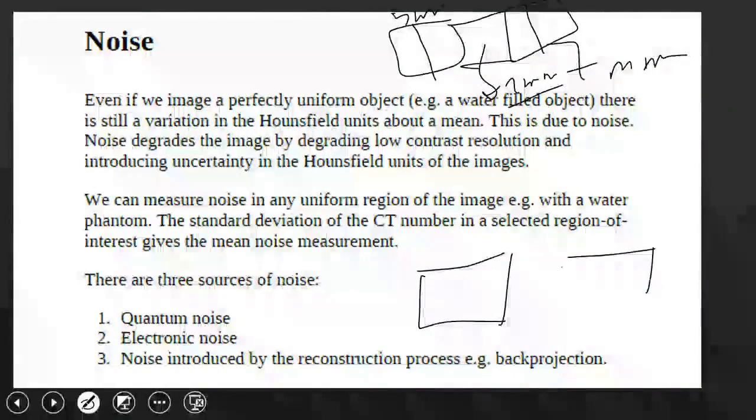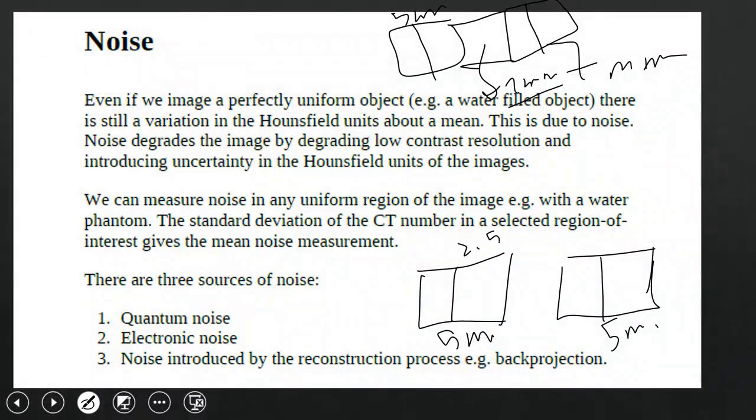It means that this is 5 millimeters and the section after it is also 5 millimeters. Now let's calculate. We said the distance from the midpoint. So from the midpoint of this section, how much is here and how much is there, doctor? 2.5 here and how much here? So what is the gap? In this case, it is 2 millimeters. Therefore, if the interval is greater than the slice thickness, the difference when subtracting the two is the gap, or that is the data loss. Okay? If the interval is less than the slice thickness, then that difference is the overlap between them.